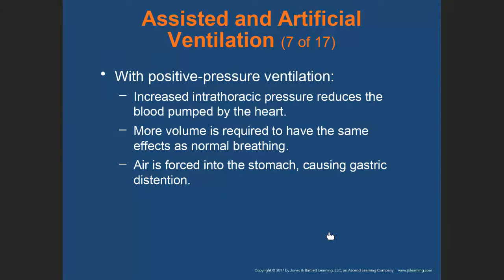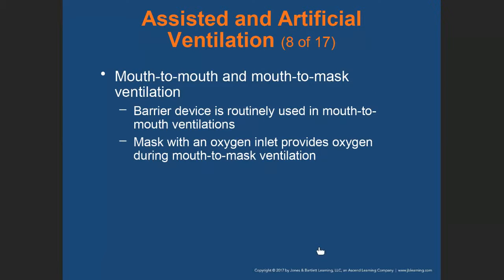Now, when you start to practice, you'll discover that it is quite easily done on a mannequin. It's not like that in real life. So if you're not properly positioned in the airway, you're not going to get air into the lungs, right? And I'll show you where your fingers need to be in order to ensure that the airway is properly positioned when we meet face to face. Very important skill. Now, mouth to mouth and mouth to mask, we don't really use mouth to mouth anymore. You can consider that for family members or loved ones. We definitely use the mouth to mask. It's a very good equipment to have. Right?